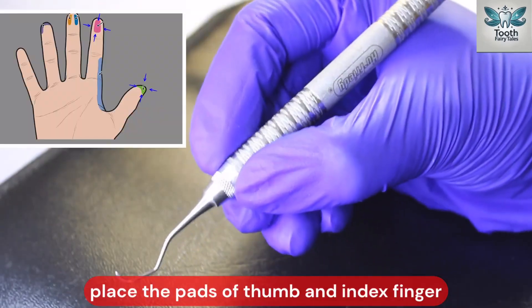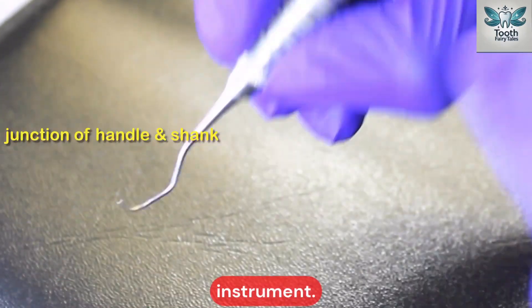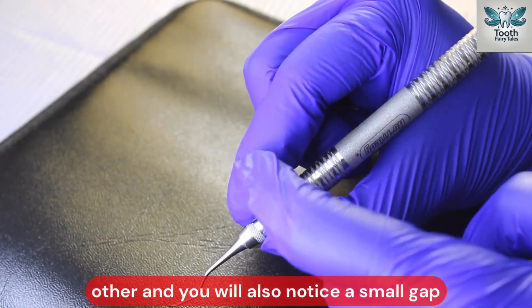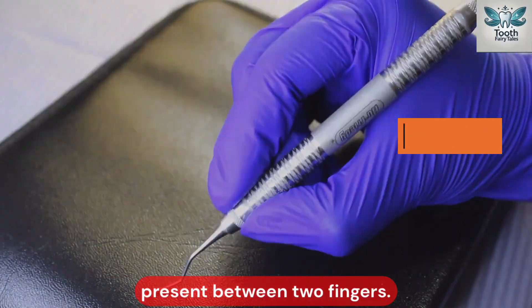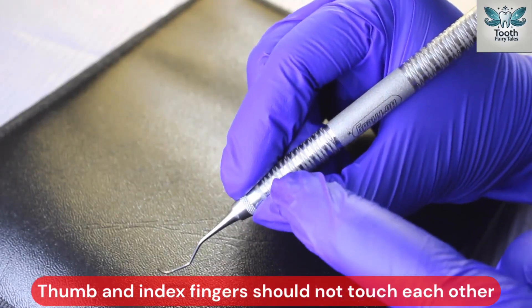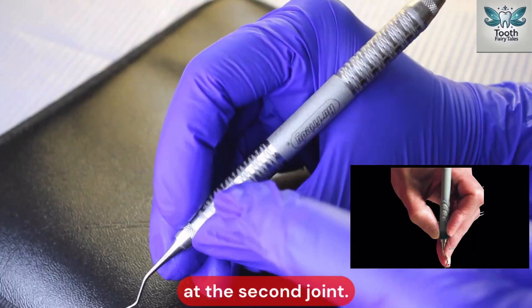Place the pads of thumb and index finger near the junction of the handle and the shank of the instrument. Notice that my finger pads are facing each other and there is a small gap between the two fingers — through that gap, you can see the instrument. Thumb and index fingers should not touch each other, and always fold the index finger at the second joint.